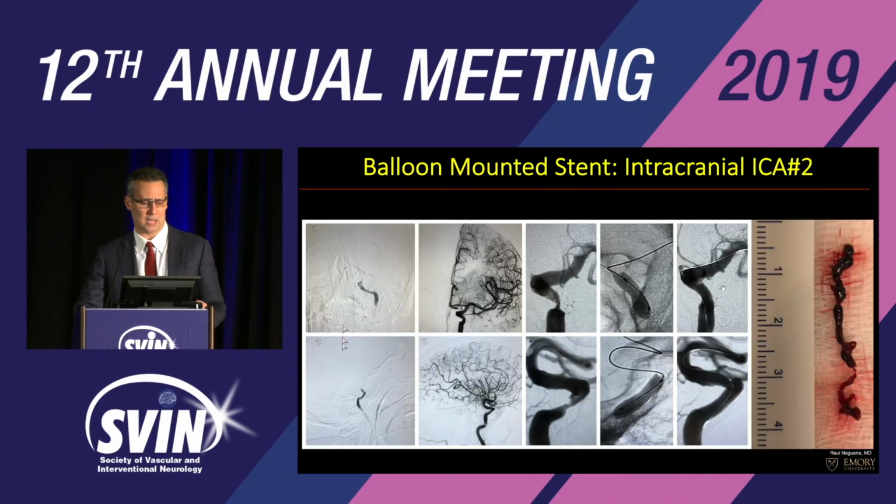It is a different case in the contralateral hemisphere. Again, I like to show this because step one is debulking the clot. It was the ICA occlusion. You remove the clot first with the stent retriever, underlying lesion. You drop your balloon-mounted stent.